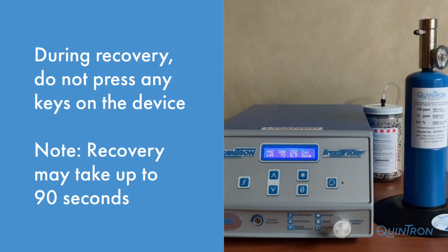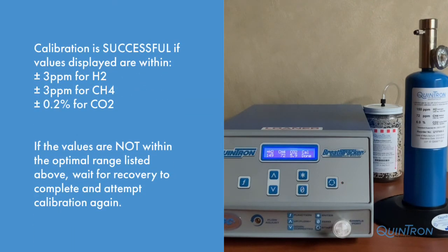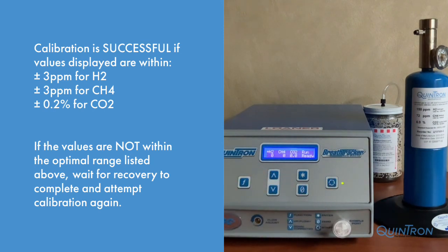Verify that the values for hydrogen and methane are within plus or minus three parts per million of the gas tank and 0.2% for the carbon dioxide. Now that the status light is blinking green, the machine has finished its recovery procedure. You may press the Start key to clear the Cal Done screen and ready the machine for a patient sample.